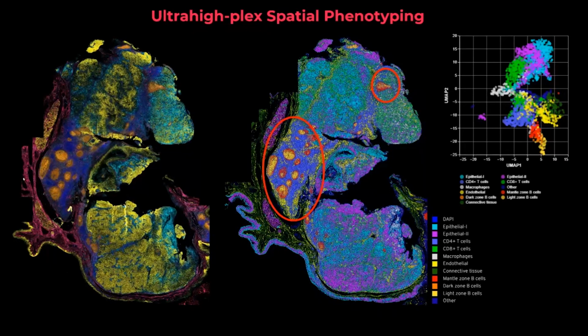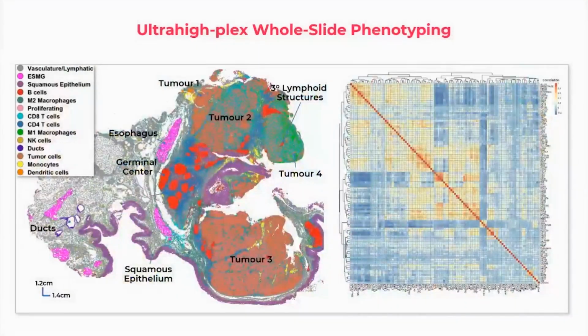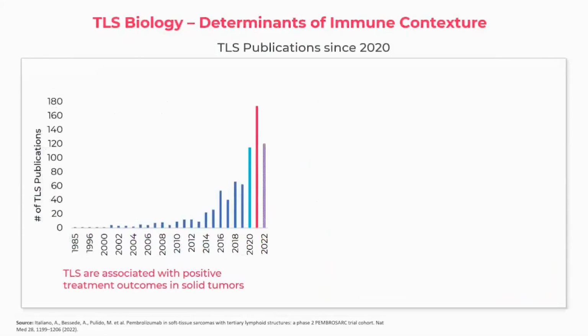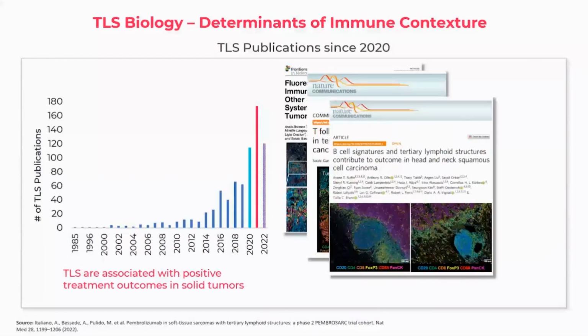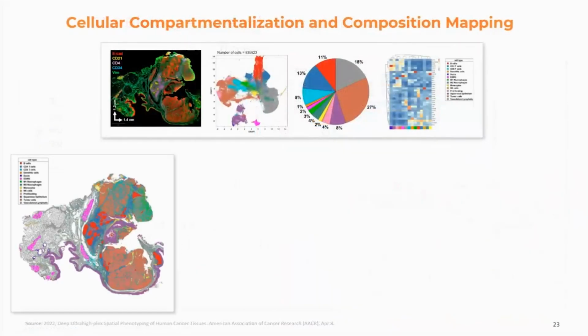These TLSs are absent in the top of the tumor and the bottom. And so we can break this tumor down into subtumors, and we can see that these tertiary lymphoid structures exist in tumor region 4 almost exclusively. We know that these tertiary lymphoid structures sustain an immune responsive microenvironment, there's a lot of literature showing this. And this is what we see in this patient specifically.